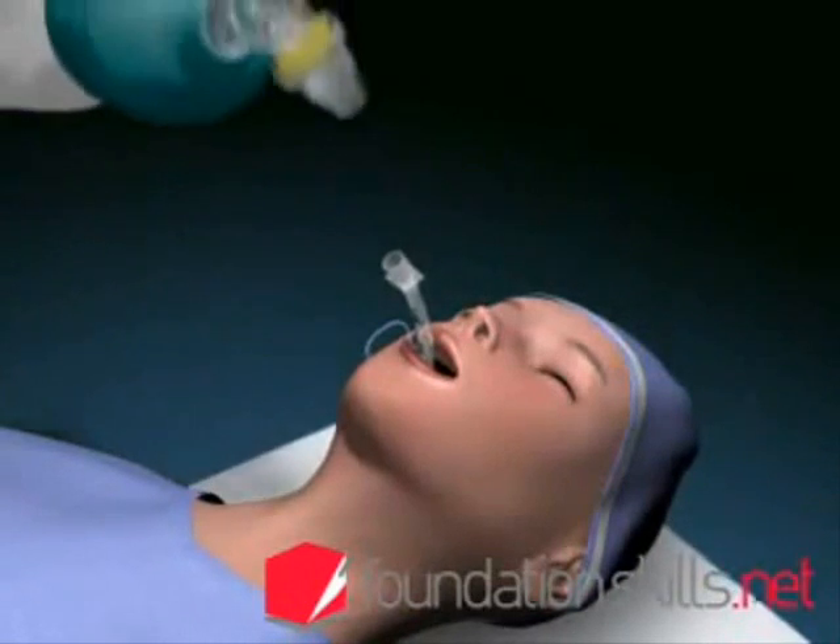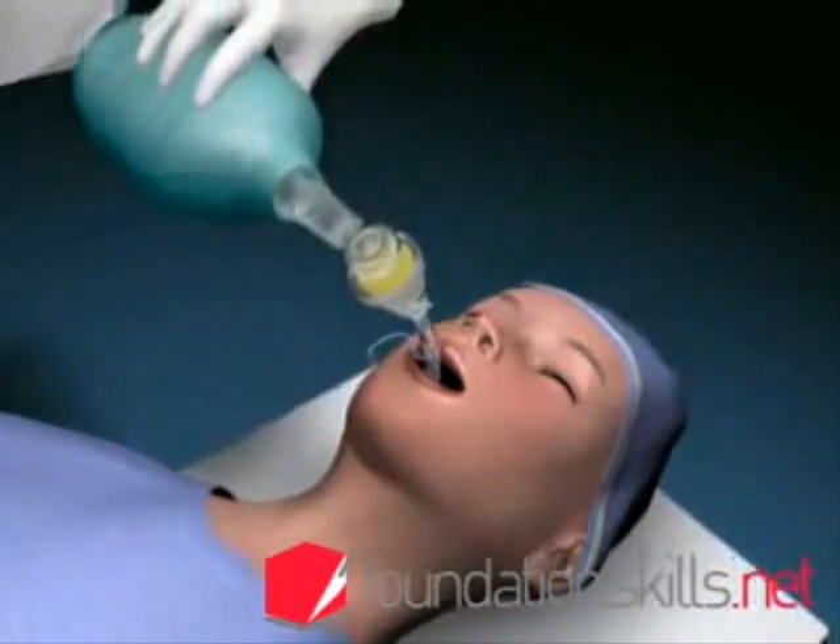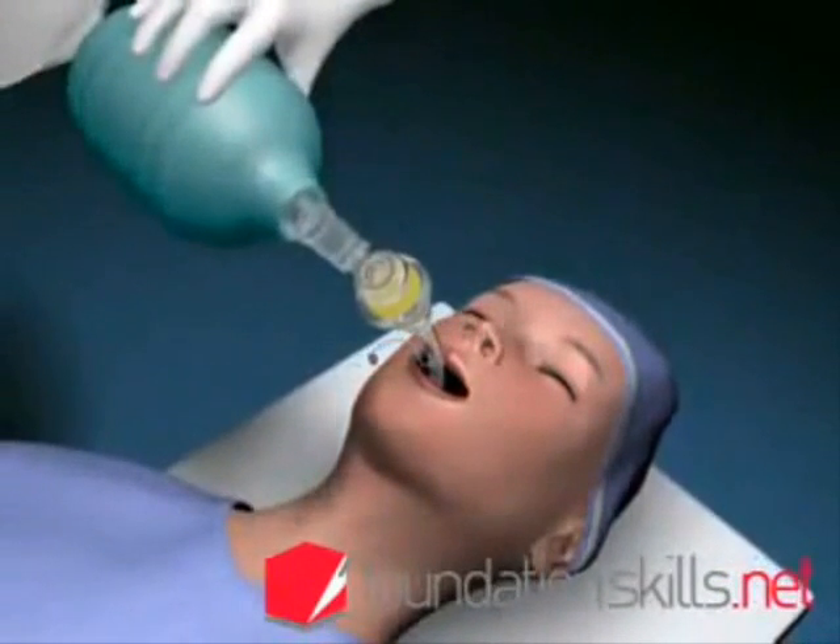Attach the tube to the bag and valve apparatus and ventilate the patient with the oxygen flow on 12 to 15 litres per minute.